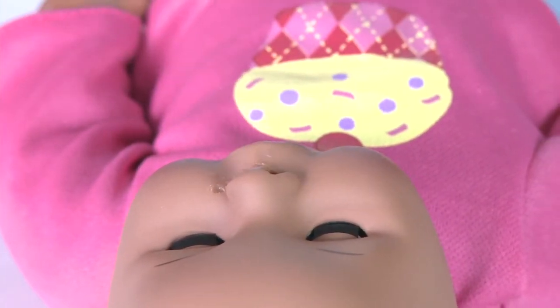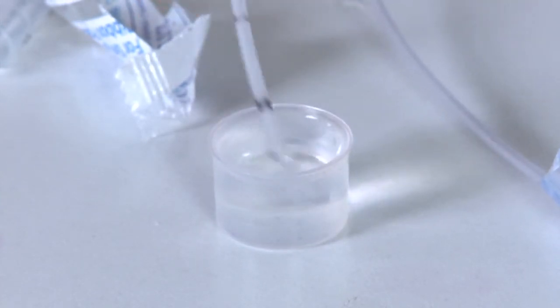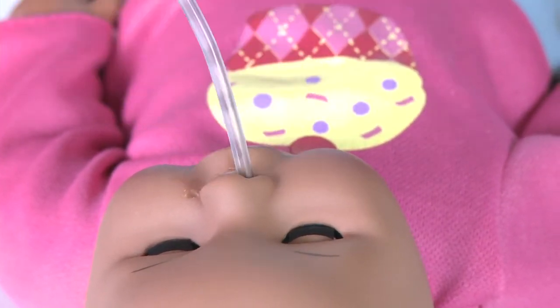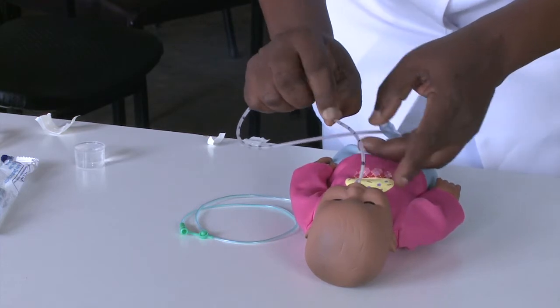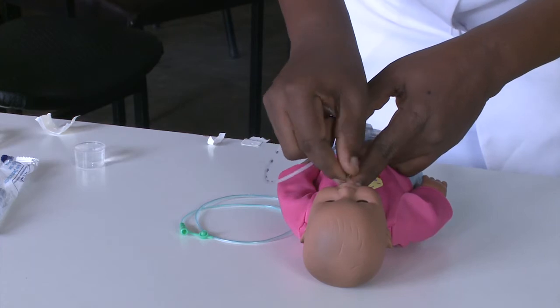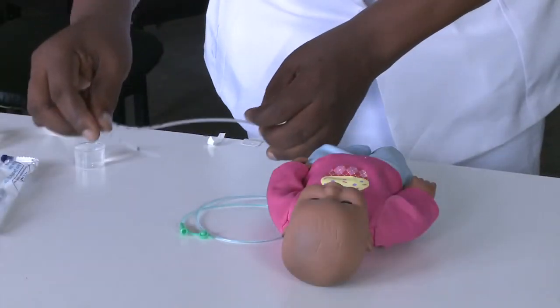Usually we'll have a bowl of water near you to clear the tube. If I know that the nose is clear, I'll go into the mouth. I'll also suction. It should go the size that I have measured. I'll suction, then take it out. I know that the airway is now clear.